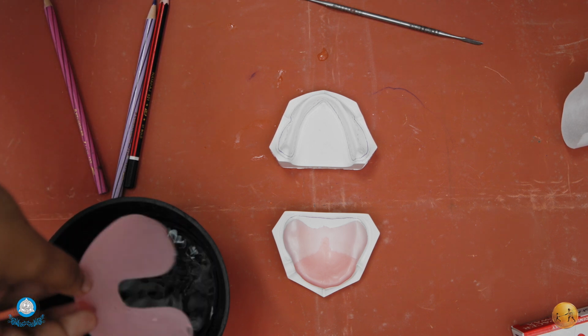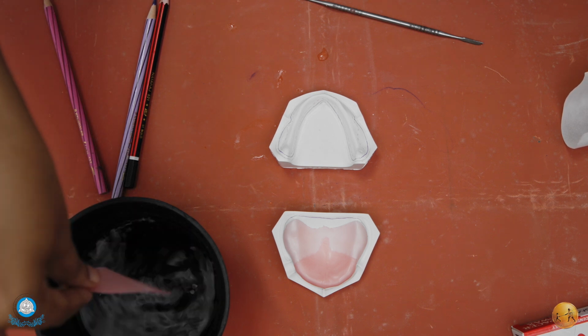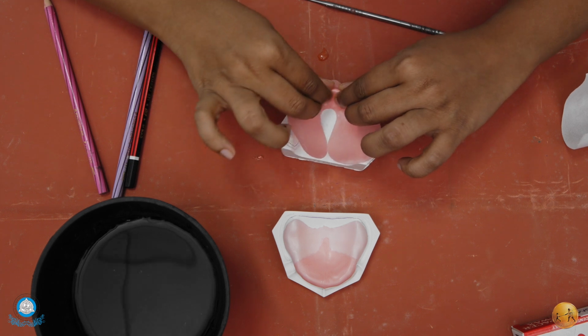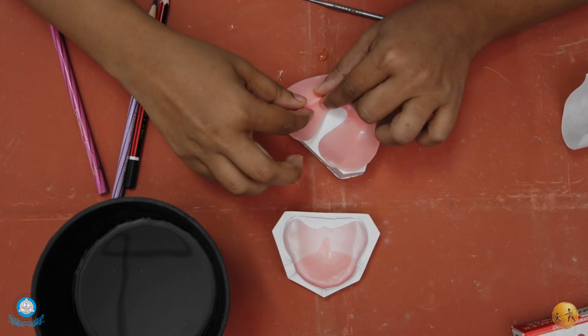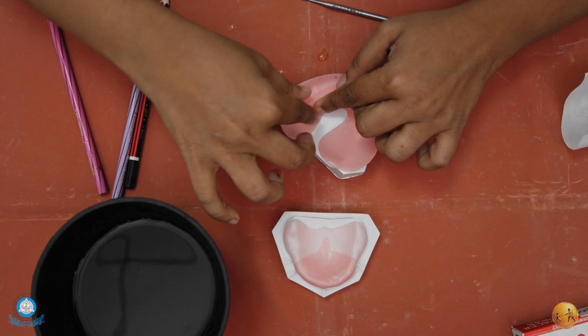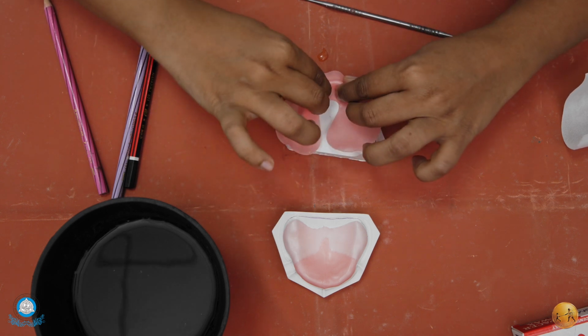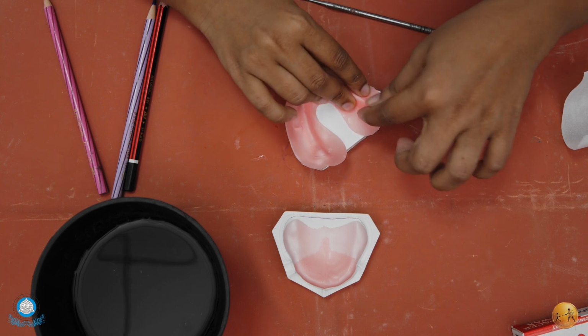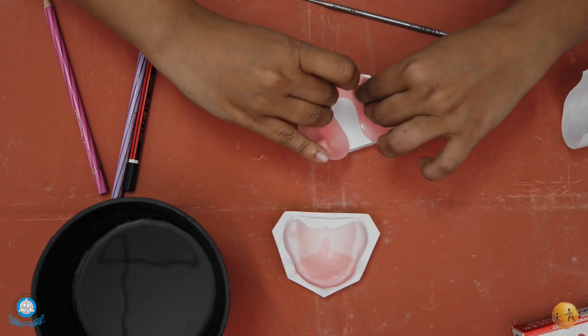Once the wax is softened, adapt it onto the mandibular cast, starting at the midline. With the fingers, use an upward to downward motion, so that there will not be any fold in the spacer.